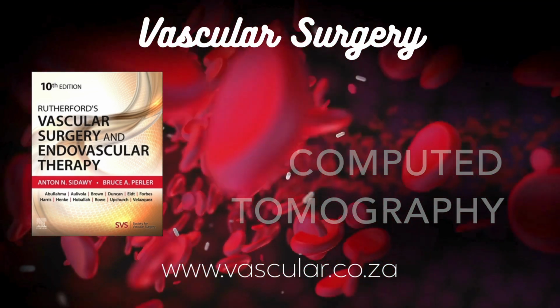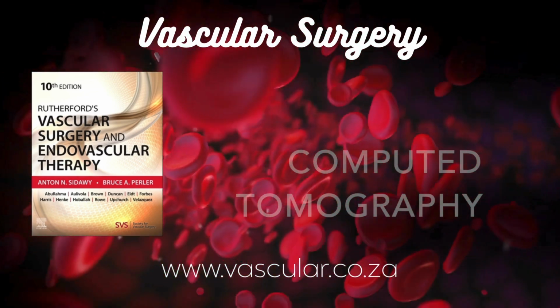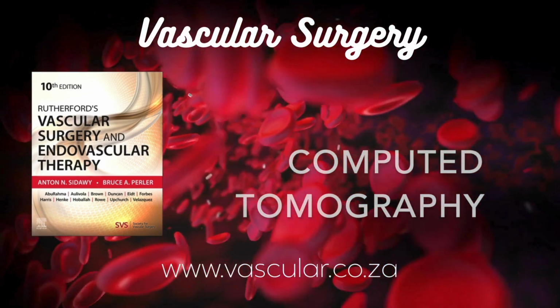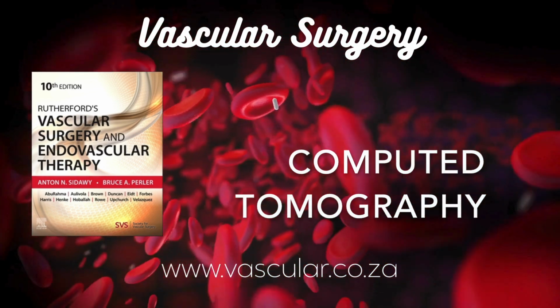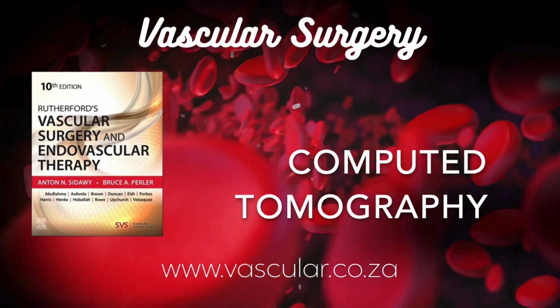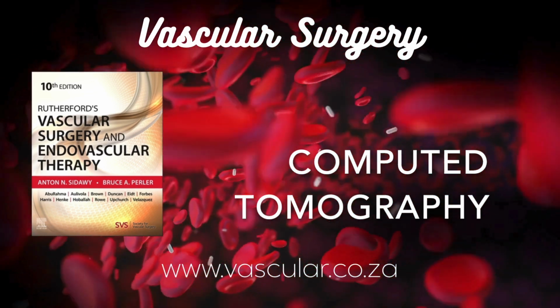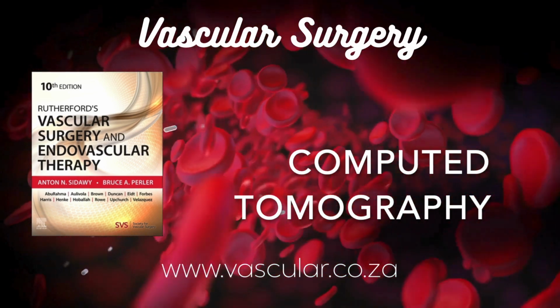Looking ahead, what's on the horizon for CT? More 4D imaging, adding the time dimension to 3D, watching things move or perfuse. Techniques like diffusion and perfusion, already big in MRI, are getting better in CT. Continued improvements in detectors and those noise reduction algorithms always pushing for lower dose. And AI, or computer-aided diagnosis, CAD, will likely play a bigger role in helping analyze the huge data sets CT generates. Okay, last big comparison.